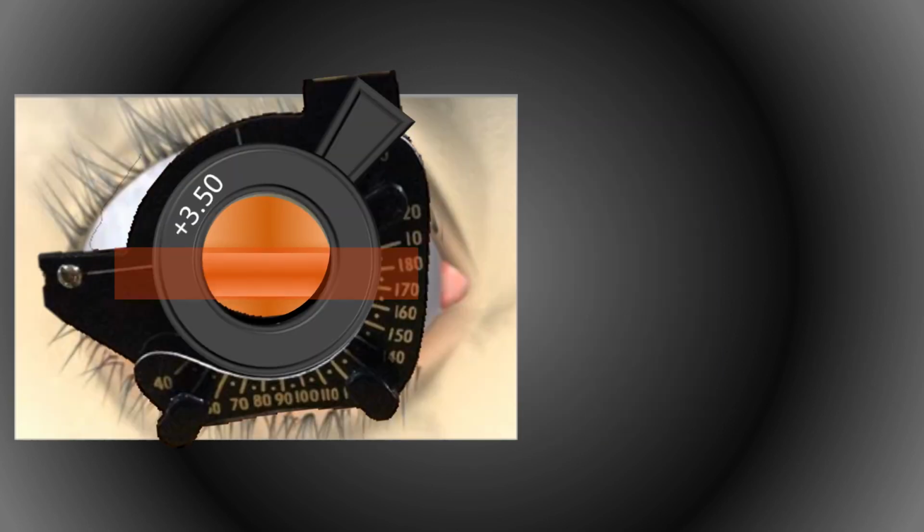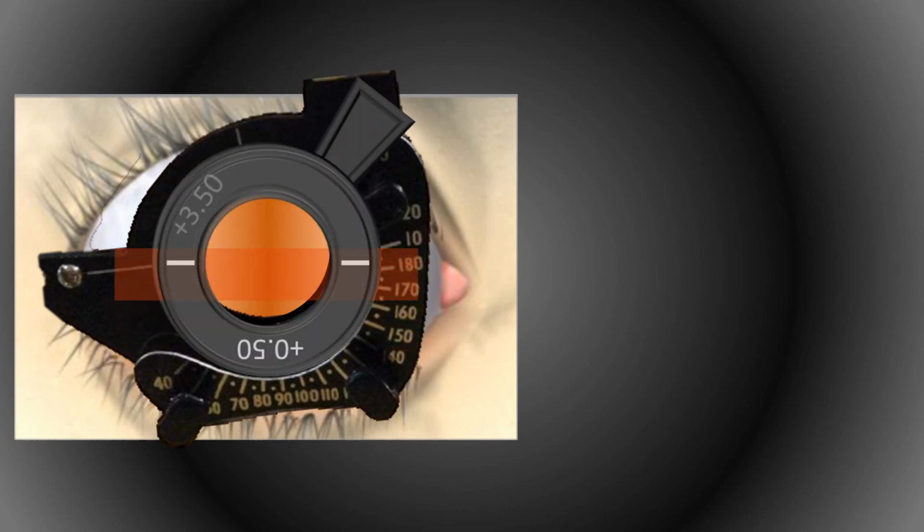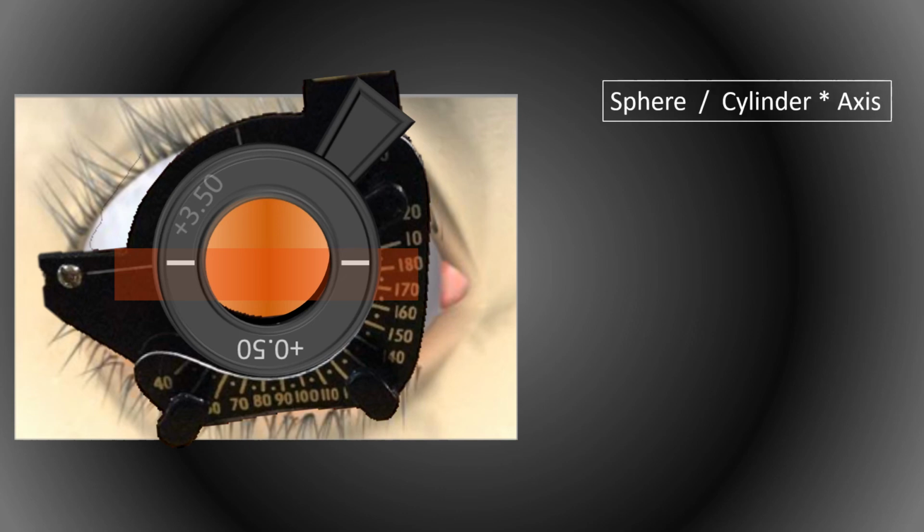Repeat the same, sweep the streak and observe the reflex. And we can see again "with" movement. So here add a plus cylindrical lens with its axis aligned parallel to the streak of the retinoscope. And with the spherocylindrical method, you can directly read the prescription from the trial frame. In place of a sphere, read the spherical power from the trial frame directly, and it is plus 3.5 diopter. Next, the cylinder power and axis are also read directly from the trial frame.